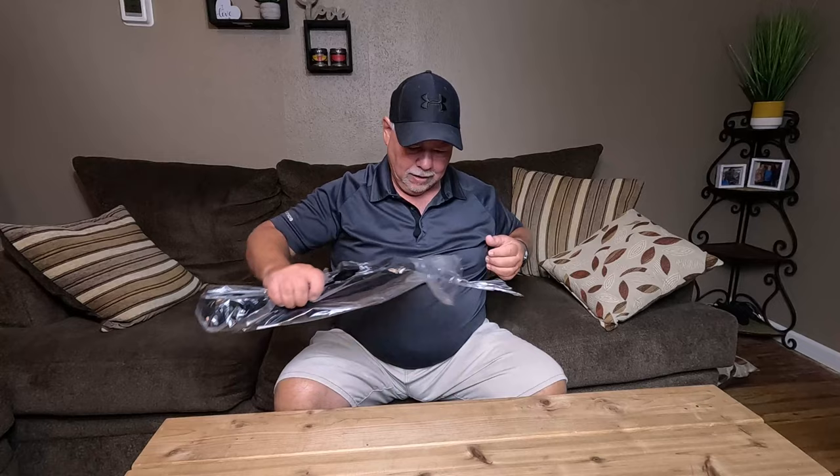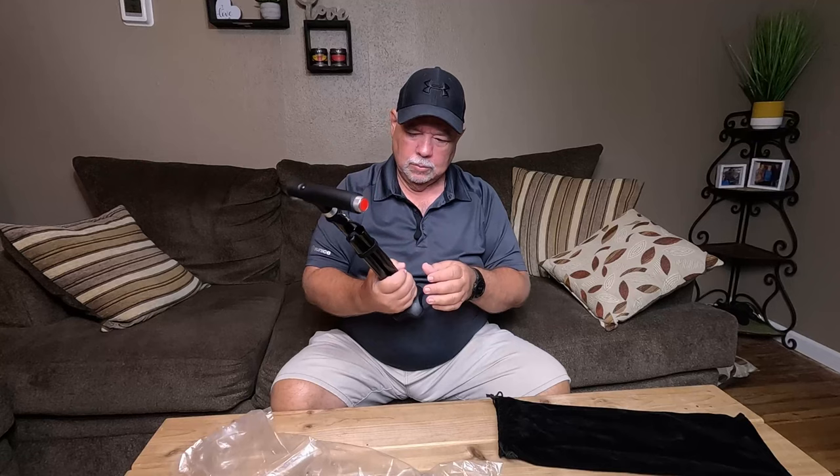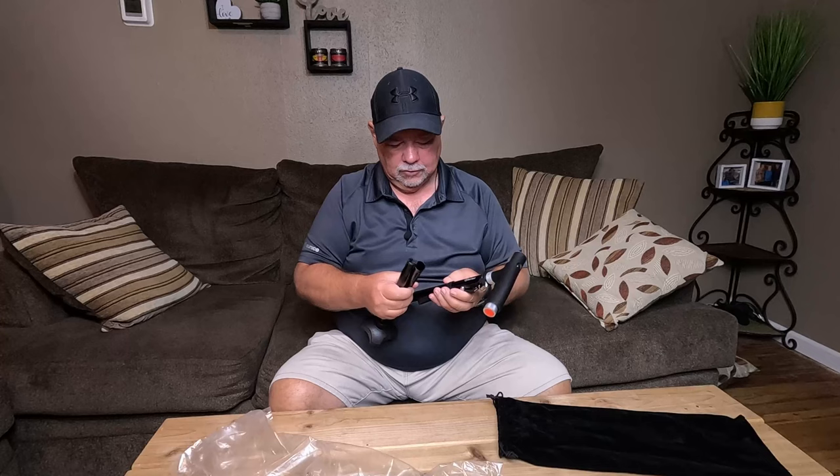This is a nice little velvety-feeling case. And it is foldable — you can fold it up and put it in a backpack. There's a nice rubber bottom right there, it stands up, a little velcro strap goes together, and there's a little stretch cord in the middle to keep it lined up.